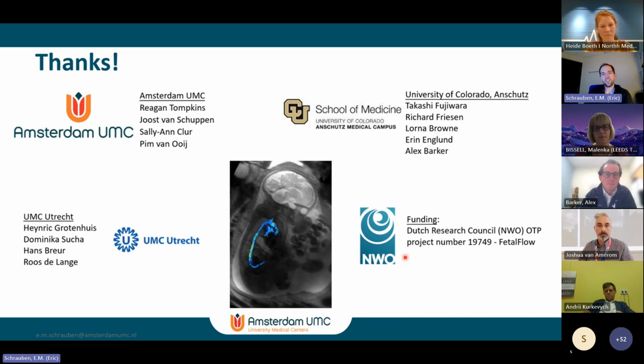So I think actually Josh has quite some experience on both Siemens and Philips, and we would be able to talk a little bit more about what's possible between the two in terms of motion correction. But I will point out that the motion correction idea here is quite similar to a lot of the work that's come out of KCL and also Sick Kids, in terms of first reconstructing a motion resolved or dynamic data set to identify motion, and then correcting the k-space data itself before doing your final reconstruction.